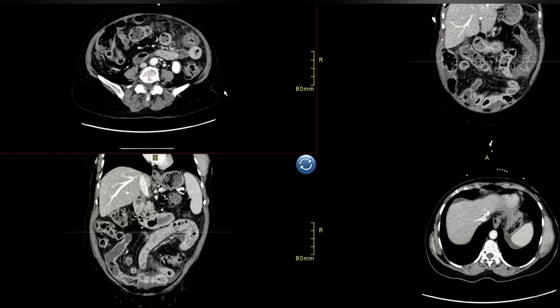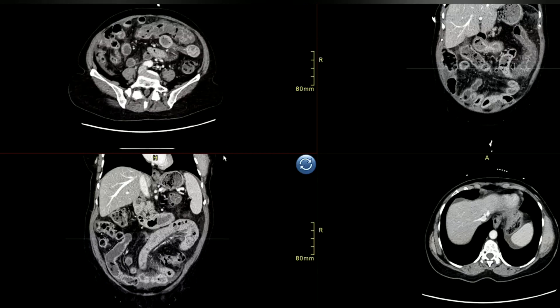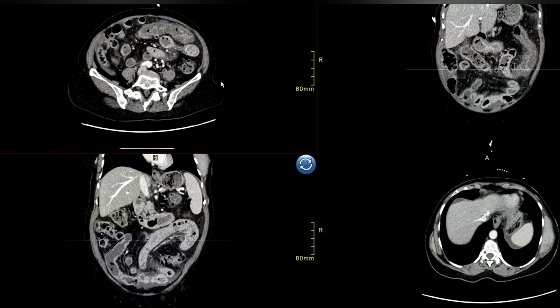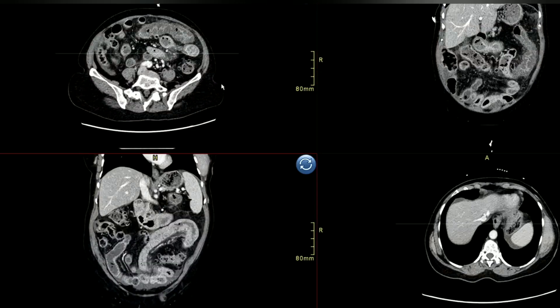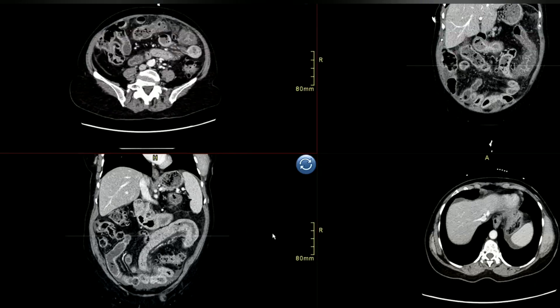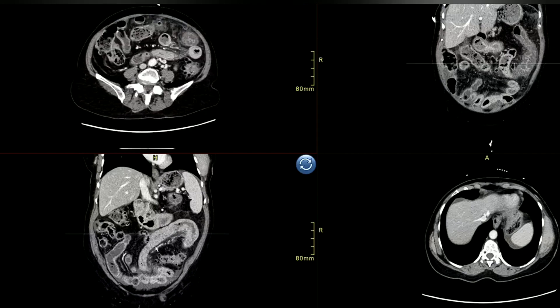On the left hemiabdomen, most of the structure is large bowel. However, no dilatation of the bowel is noted and no free air is seen. Regarding ischemia — there is no ischemia. There is thickening of the descending colon on the coronal image.